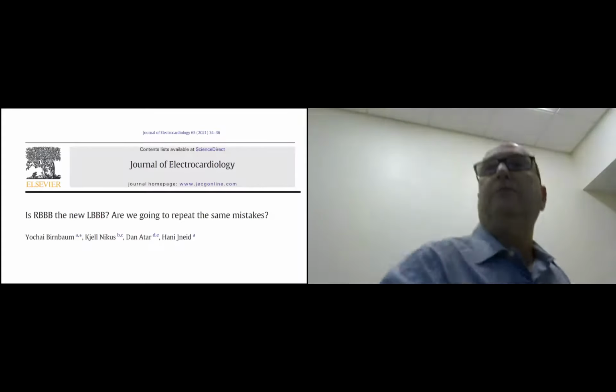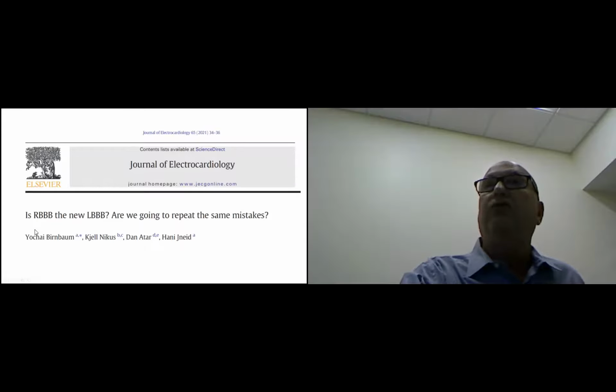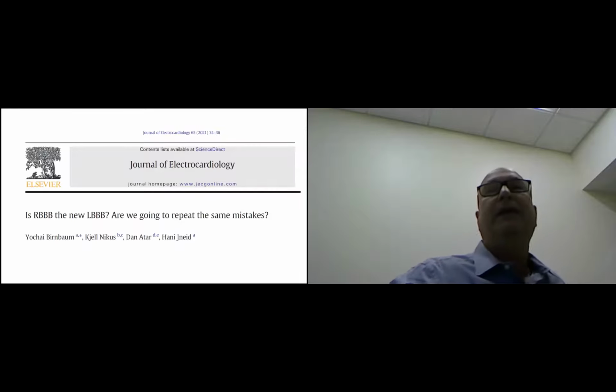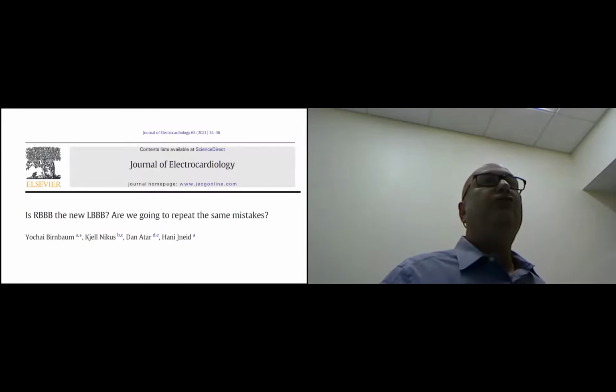So the rest of the presentation is based on an editorial that we wrote in the Journal of Electrocardiology this year. Is right bundle branch block the new left bundle branch block? Are we going to repeat the same mistake? And when I say it, I mean that it was obvious that it is very difficult to diagnose STEMI, ST elevation, in patients with left bundle branch block.